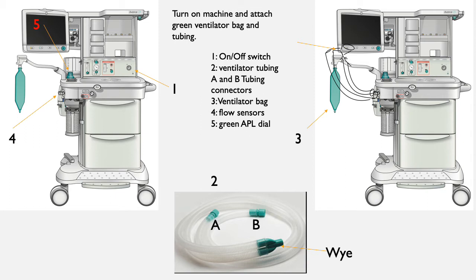As shown on the screen, the power button is located at 1. You can flip the switch to the right to turn on the ventilator. While this is happening, you can hook up the tubing shown in 2 and the ventilator bag shown at 3. The ventilator bag will simply slide on.